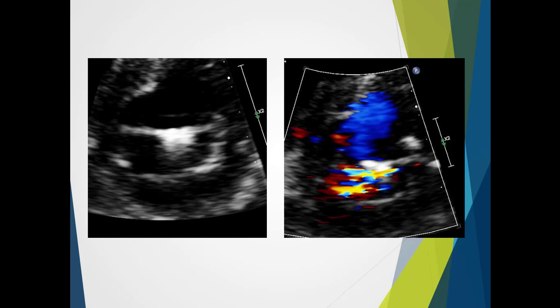From our parasternal long axis shot earlier, this is now a parasternal short axis shot of the mitral valve. Again, we can see this bright area here where the actual clip holds the anterior leaflet and the posterior leaflets together. And even though there is the clip, there's still some resulting mitral regurgitation.